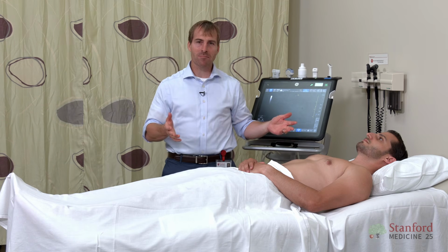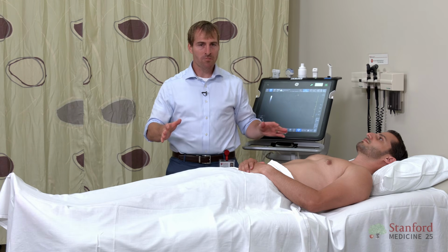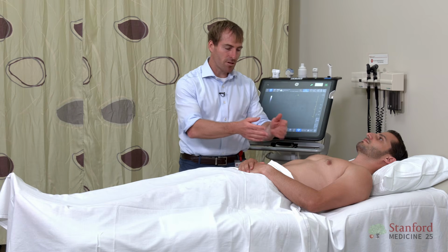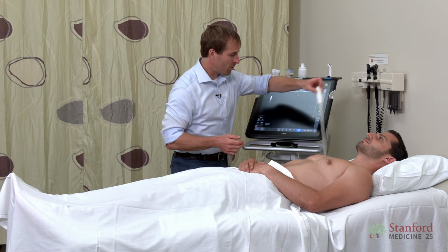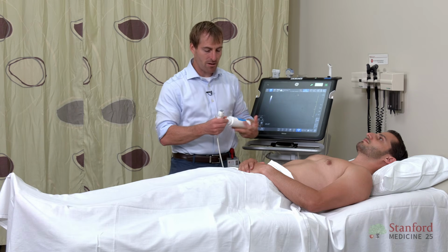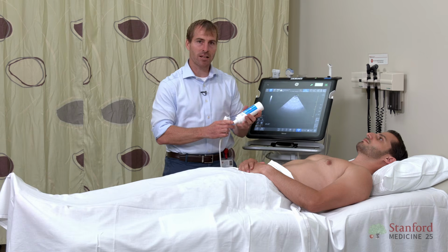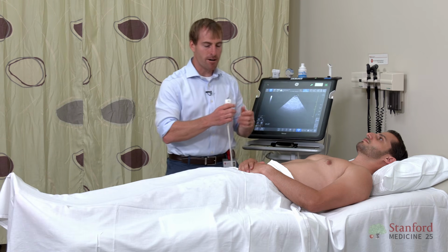So to do this, in general, you're going to have your patient lying flat. They can have head of bed up a little bit for patient comfort, but in general, fairly flat is better. You need to be able to expose the abdomen so that you can get the probe to where it needs to be. I'm going to be using the cardiac probe today. You could use the abdominal probe. They both work. I do have it on a cardiac setting. As an internal medicine trained doc, that tends to be what I put it on, though there are some other people who might use the abdominal settings.